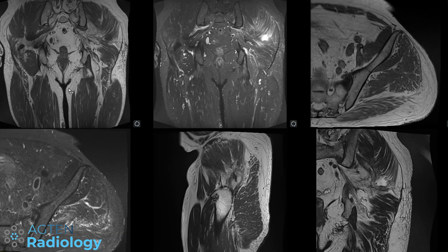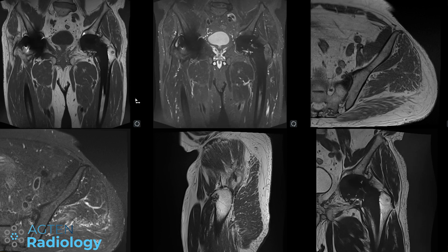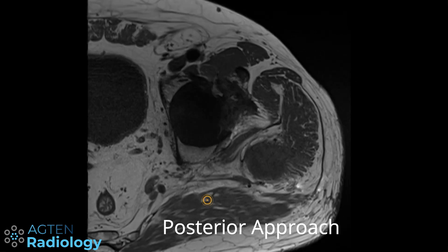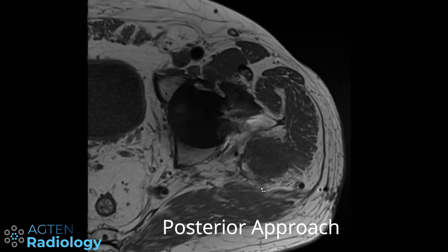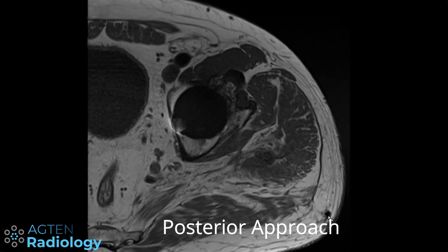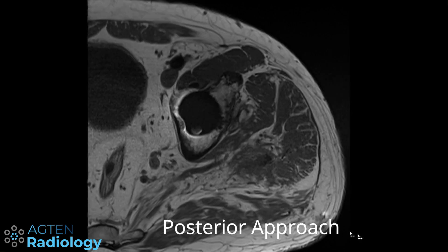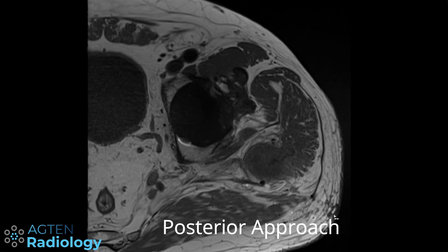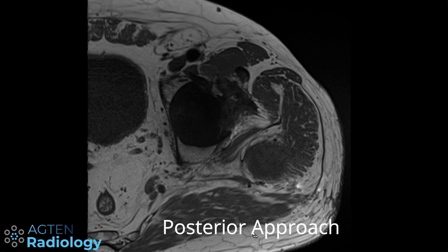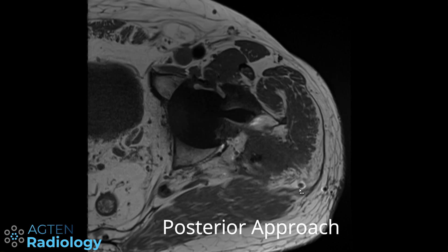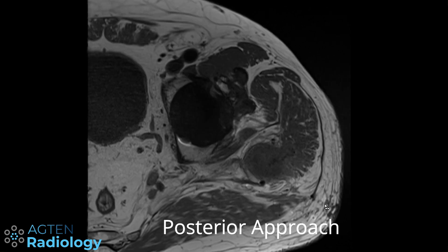This is an example of a patient after a posterior approach. Again, looking at the axials and scrolling through a little bit faster than usual, you can see the susceptibility artifacts here from a posterolateral or posterior angle, running between the gluteus maximus muscle and the gluteus medius muscle.